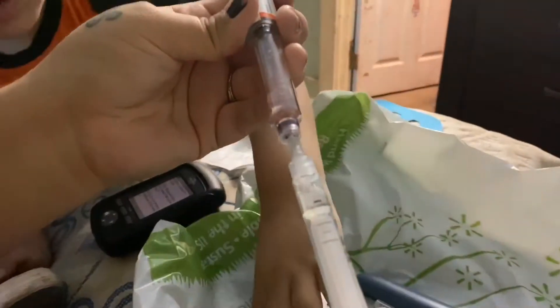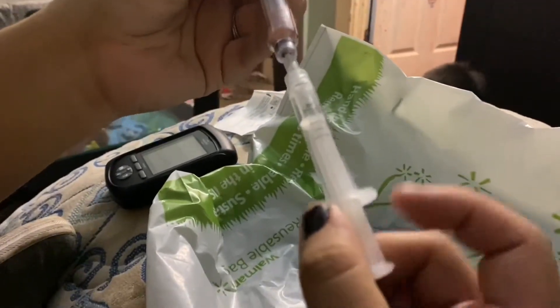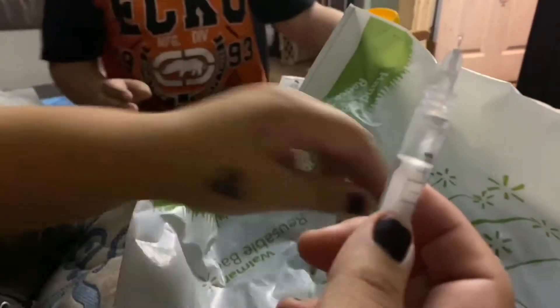You can see it move. I try and get a little more and then just squeeze the rest out until I get to 100 right there.